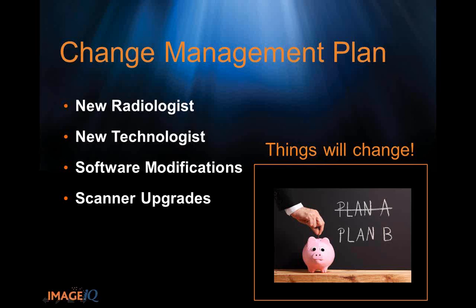If you know a trial is going to be that long, it might be a good idea to have a phantom-based system to do your quality, your QC, because then not only does it give you an idea of what's changed within a site, but now you can compare across sites, across all the years, and across vendors. Certainly 25 years is an extreme, but we see trials for our clients that we're managing that are 5, 6, 7, 10. So it's not unusual.